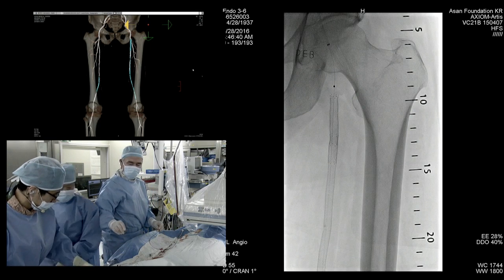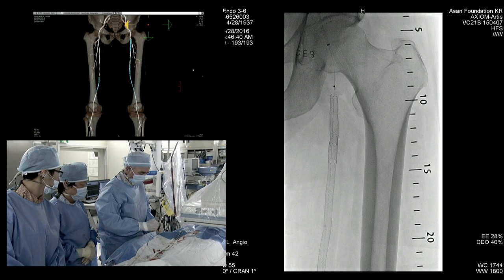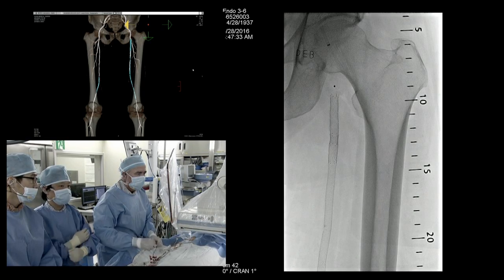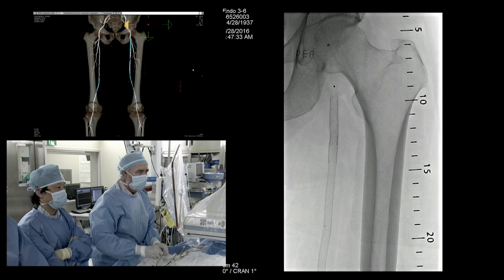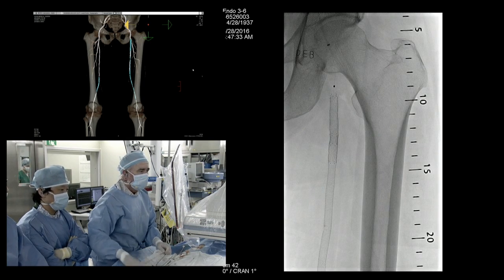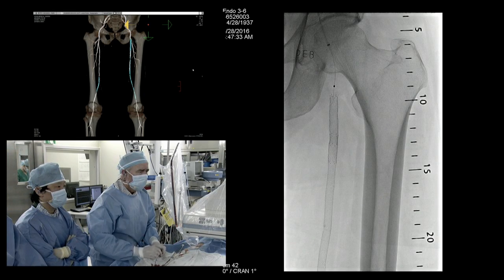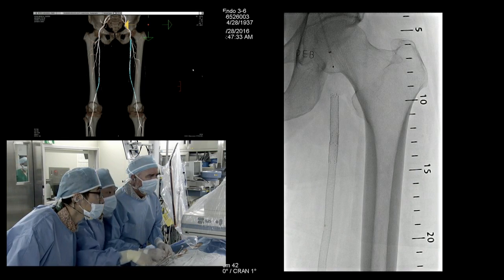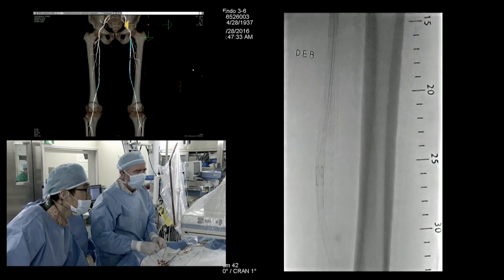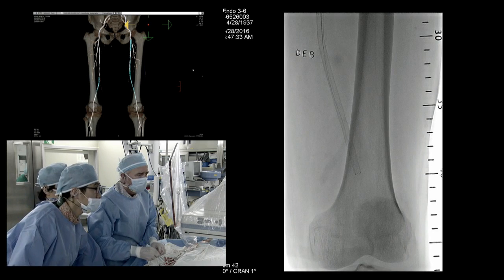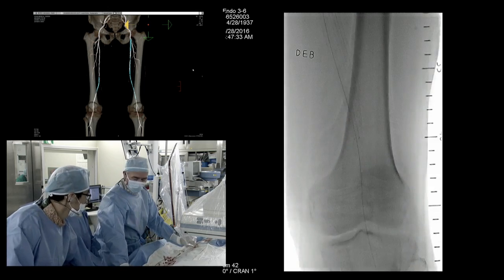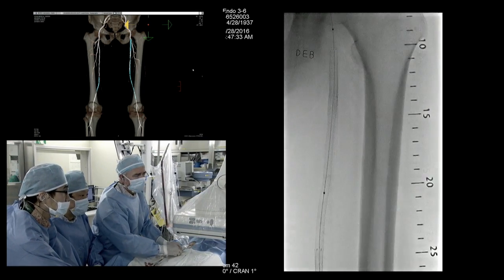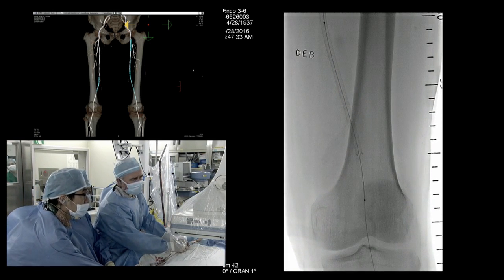We picked the IN.PACT Admiral — 5-millimeter diameter by 150-millimeter length. Nice to have the longer lengths here in Korea than we have in the U.S. In ISR lesions, it's unusual for the balloon to catch on the struts on the way down unless you have a fracture. We'll do a little test here to see where we are relative to that branch.